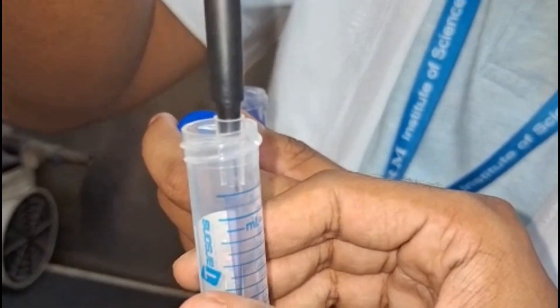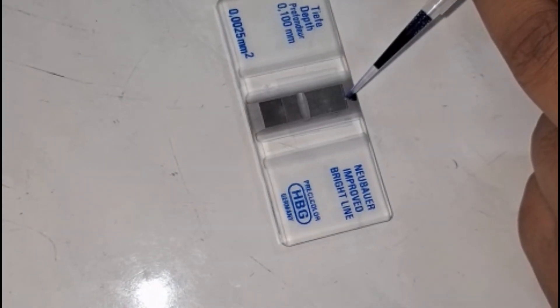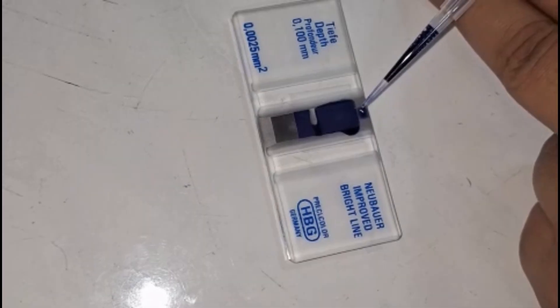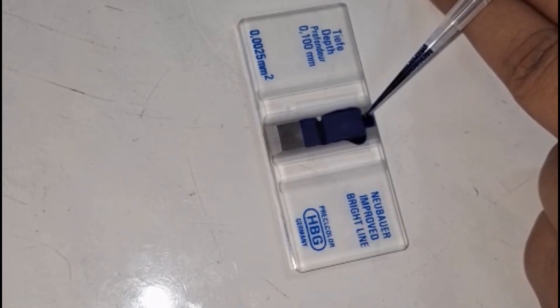Observation of Results. After incubation, observe the cells under an inverted microscope. Healthy fibroblast cells will appear as elongated spindle-shaped ones. Subculture the fibroblasts once they reach 80% confluency for further experiments.